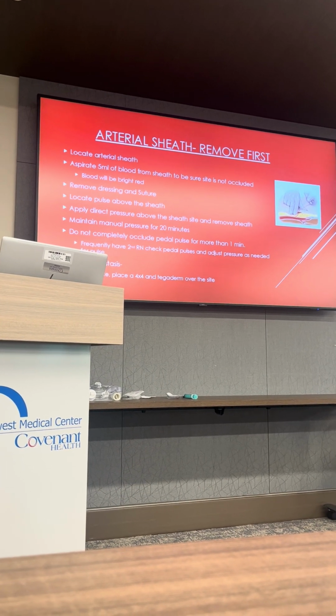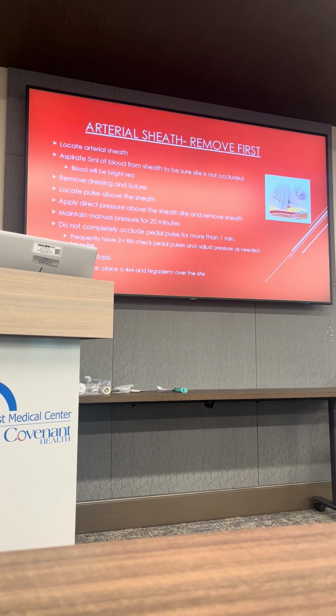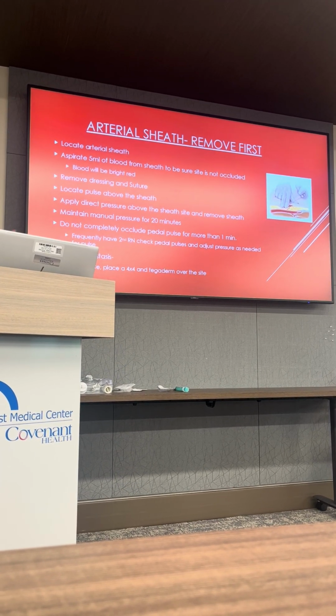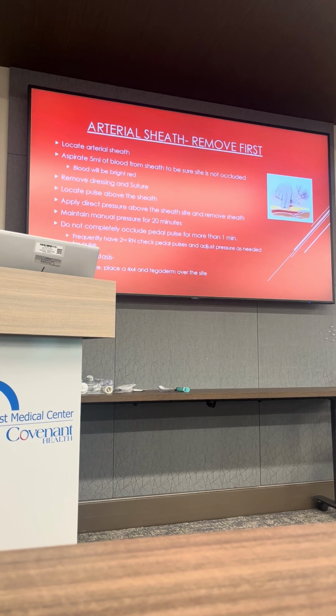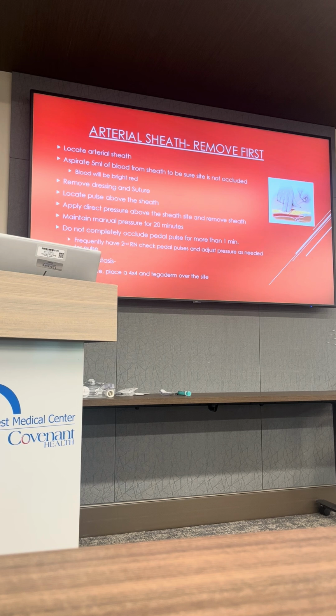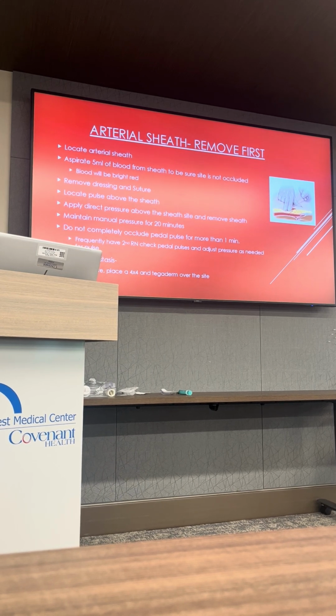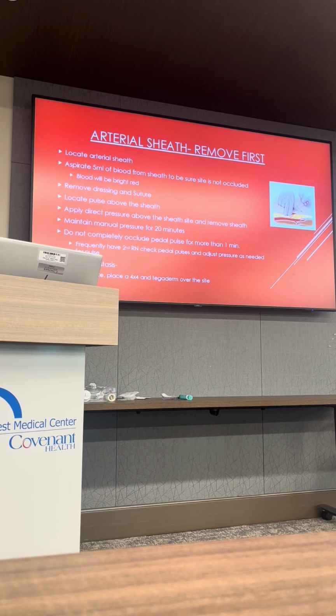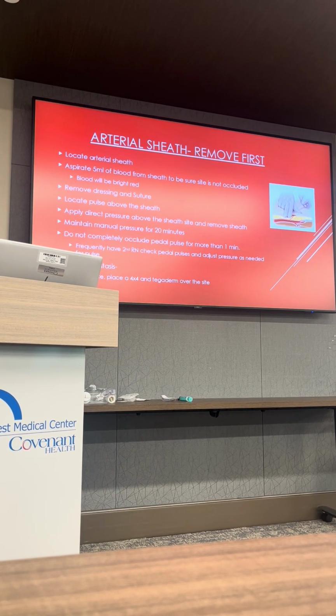It's better to go ahead and hold that more difficult pressure at first, and then you can ease up as you begin to notice that there's no more blood coming. Again, after hemostasis, you're going to want to clean the site again. You want to be gentle with this. You don't want to rub so hard that you irritate it and lose what you've stopped and have to hold pressure again. Place some gauze and a Tegaderm.